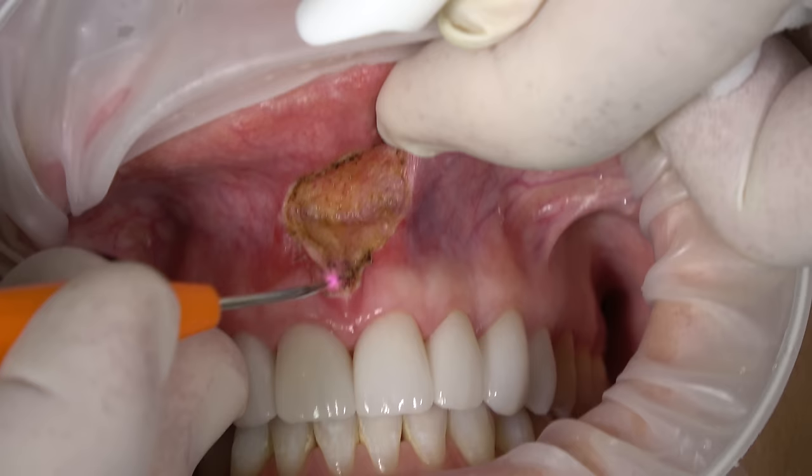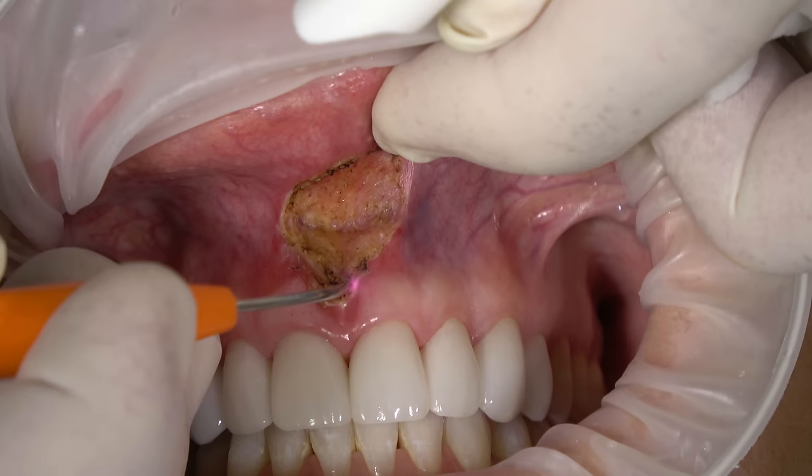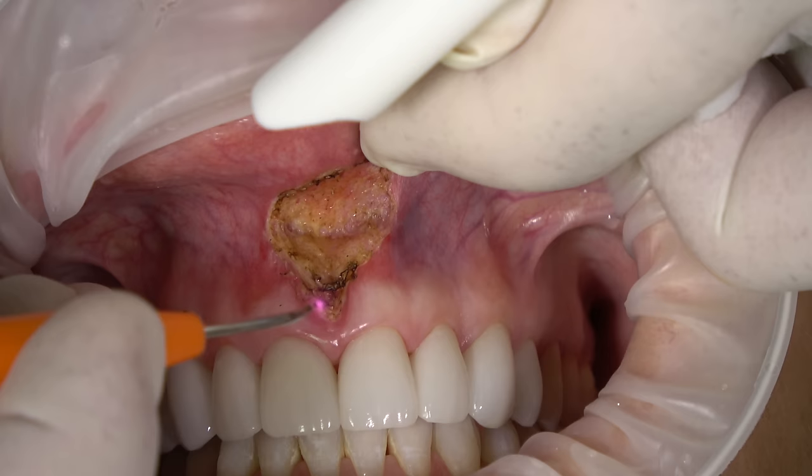Going to hydrogen peroxide. I can take this 2x2 gauze with a little bit of water, embed the tip in the gauze, put my foot on the rheostat, and just wipe it clean. Where we have a little bit of that char, I'm just going to take some hydrogen peroxide with an alternate tip and wipe that off.